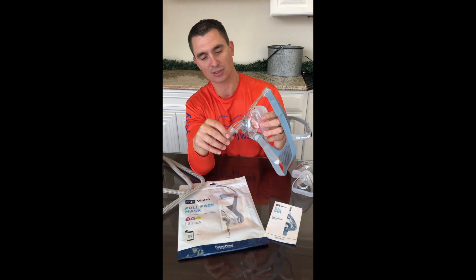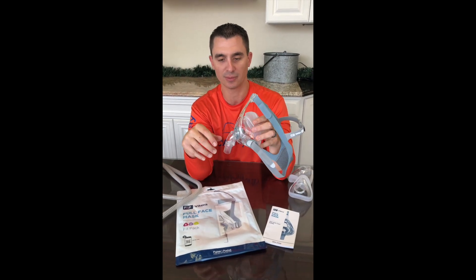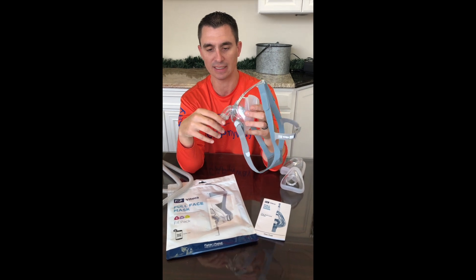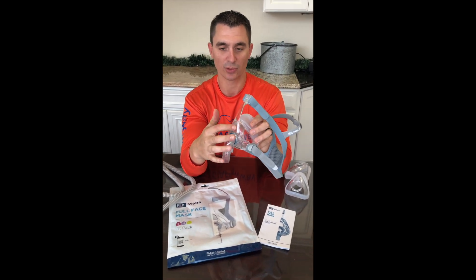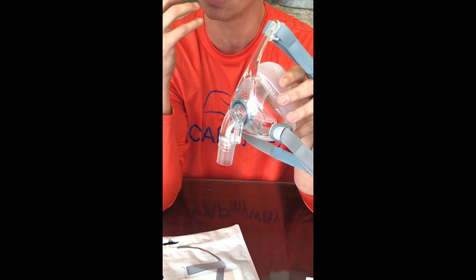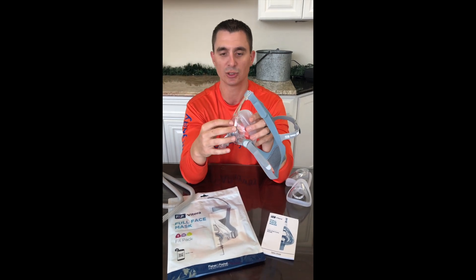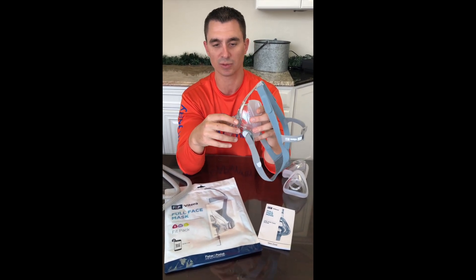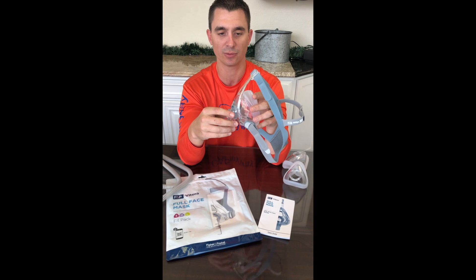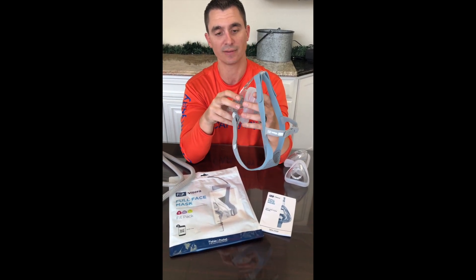The front of the mask swivels and toggles very nicely, so if you're moving around at night you're going to get a lot of freedom of movement without any kind of leakage. There is an exhalation port on the front, which was also remodeled on this particular device. On the Simplest, some people complained about feeling a little bit of draftiness in the way the exhalation ports were designed. They've completely redone it on this one, and it's made a big difference on the feeling of the exhalation.